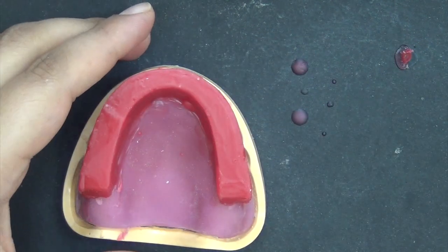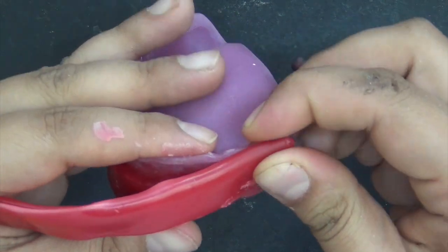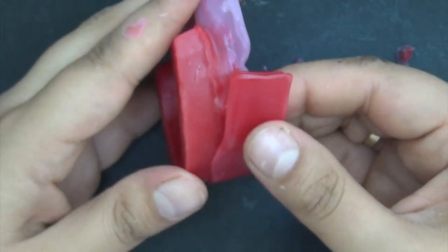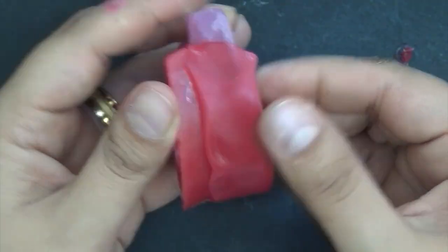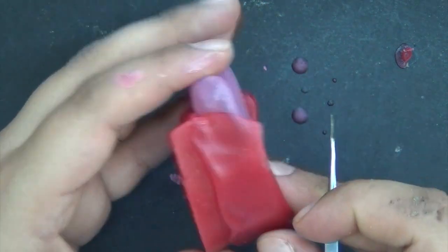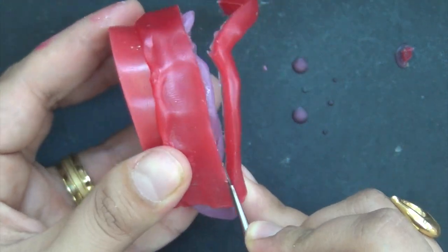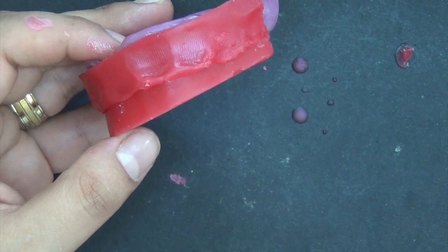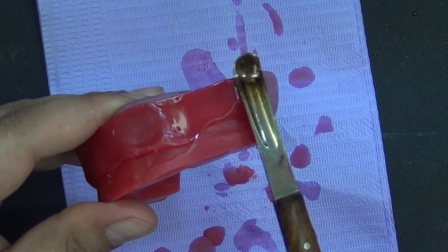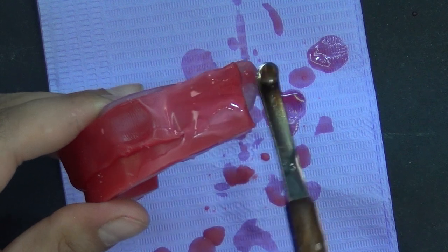Once completely sealed, use an additional sheet of wax to shape the buccal and labial flanges. Use the flat end of the wax knife to shape the rim and make sure that you're only smoothing the surface without disturbing the measurements.